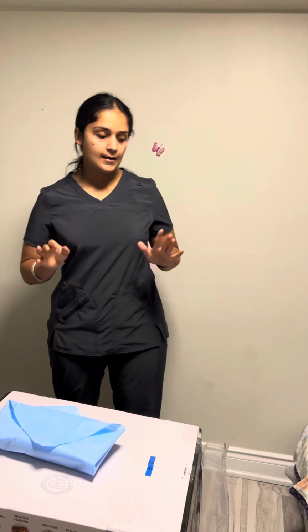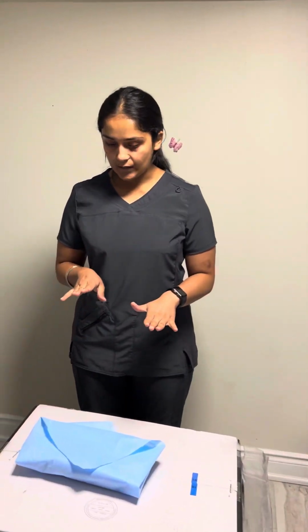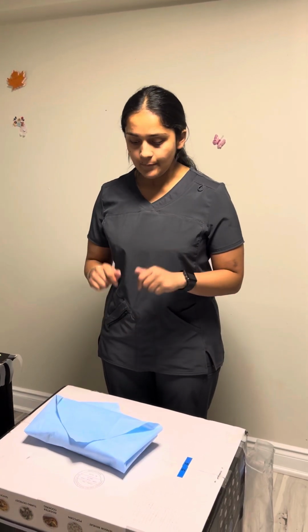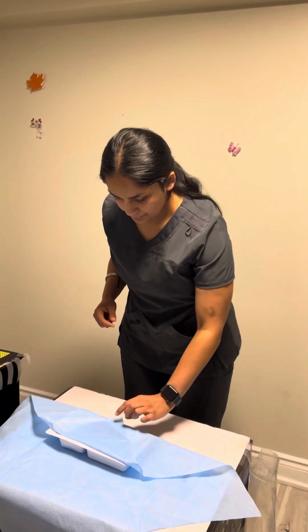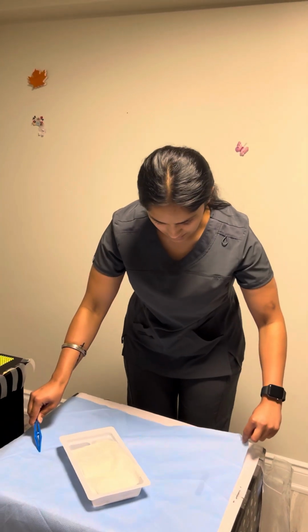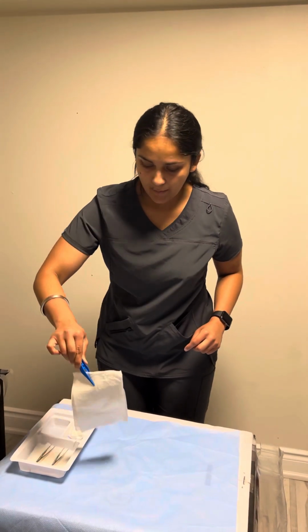Before opening the tray, I have to do my quick hand hygiene and maintain the sterile triangle, that is patient, garbage and tray, tray, garbage and patient. So I am going to open the tray. For that, I have to hold the sheet within a 1 inch border to maintain the sterility of the tray and the equipment inside. Now I am going to open the tray firstly away from me, then one side, the other side, and towards me. I'm going to manage the sheet and arrange all the equipment that I need during my procedure.